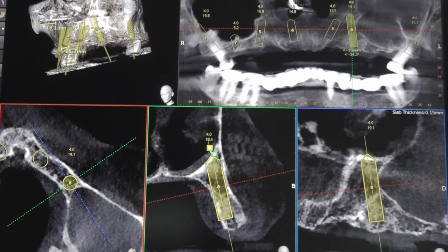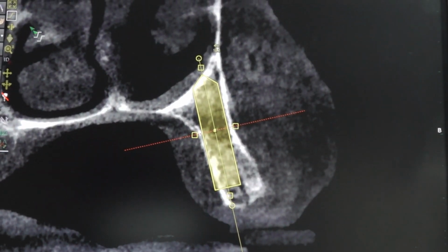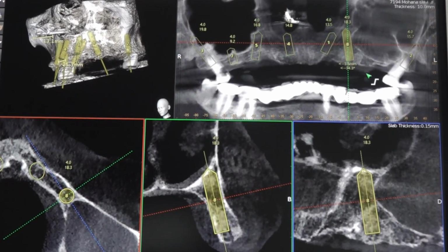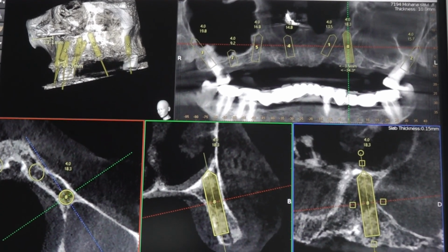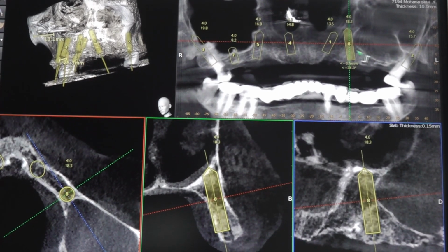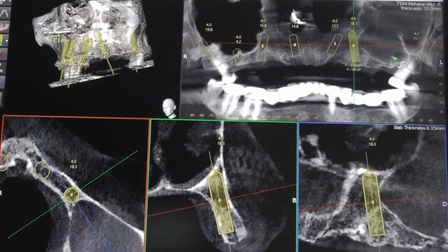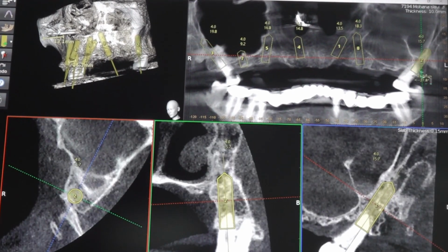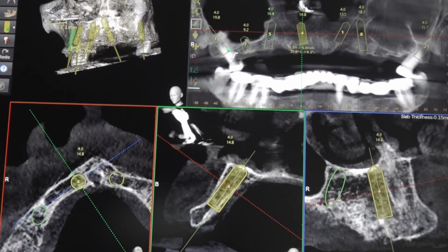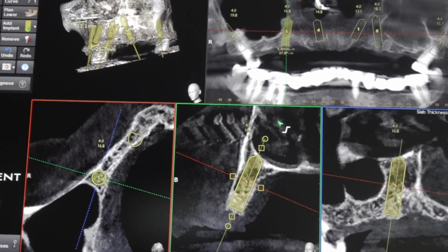So this is the classic nasomaxillary buttress implant, palatal to buccal approach. We have tilted it mesially, but we cannot bend the abutment much because the bone is soft. But bending is not necessary because it is a screw retained implant. So all the 6 implants are very, very critical positions.